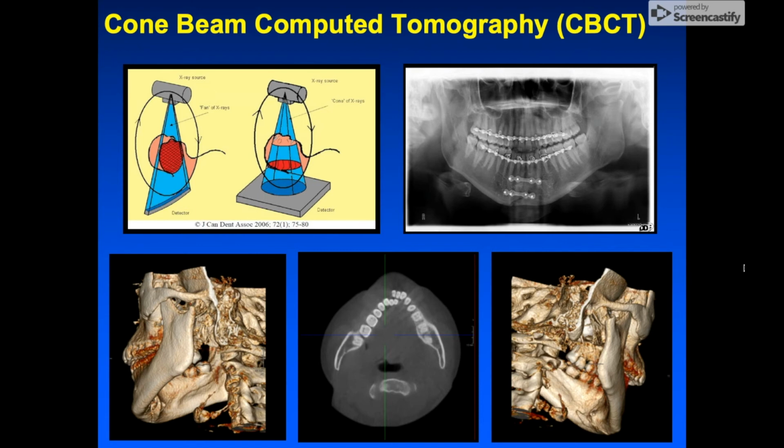Cone beam CT utilizes a low power medical fluoroscopy tube that provides continuous imaging throughout the scan. The cone beam CT uses a cone-shaped X-ray beam that transmits onto the solid-state area sensor for image capture, producing the complete volume image in a single rotation.